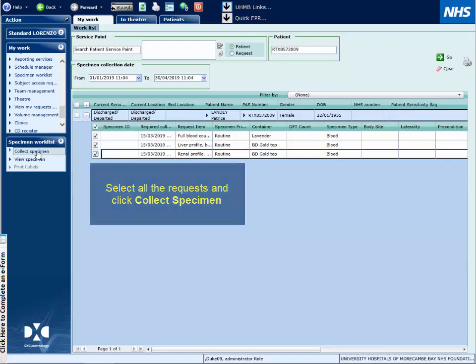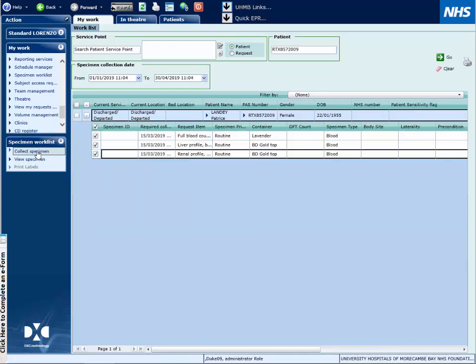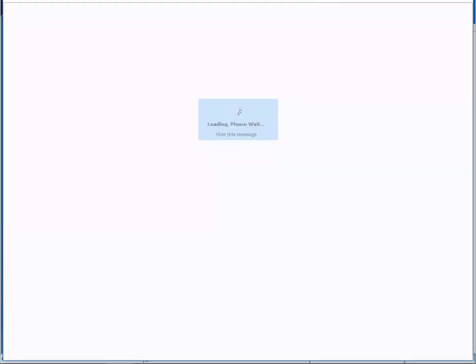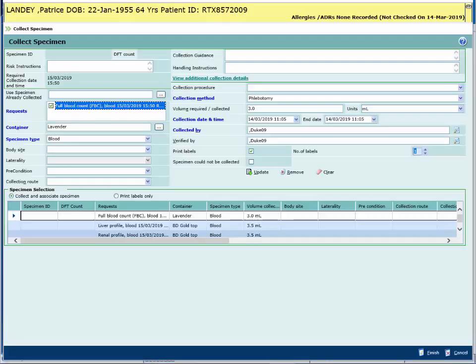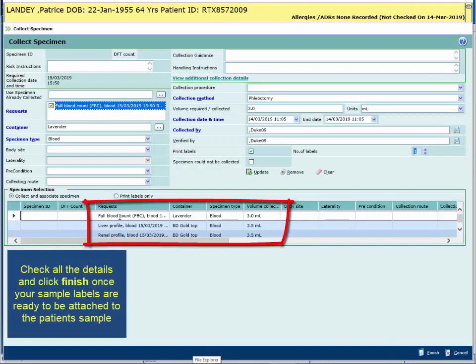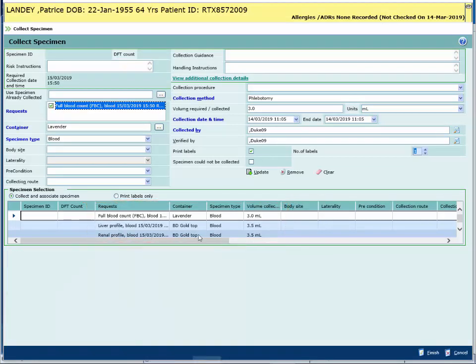Tick the top tick box and from the left select Collect Specimen. The specimen selection screen at the bottom will show you all the placed requests and the container colours.